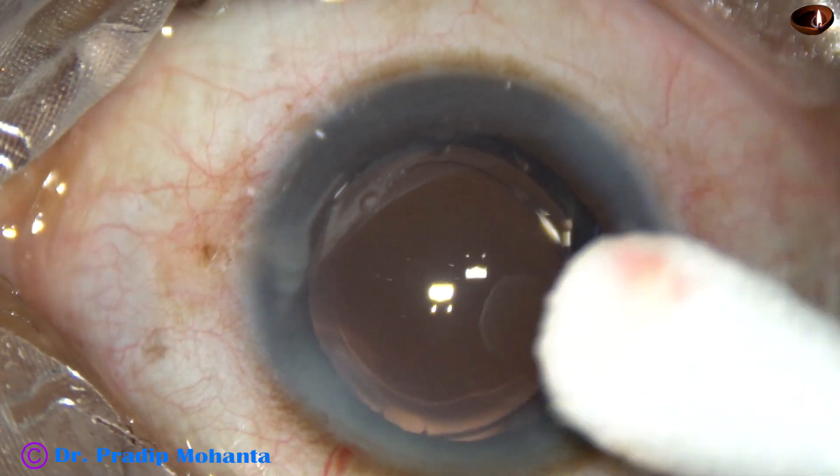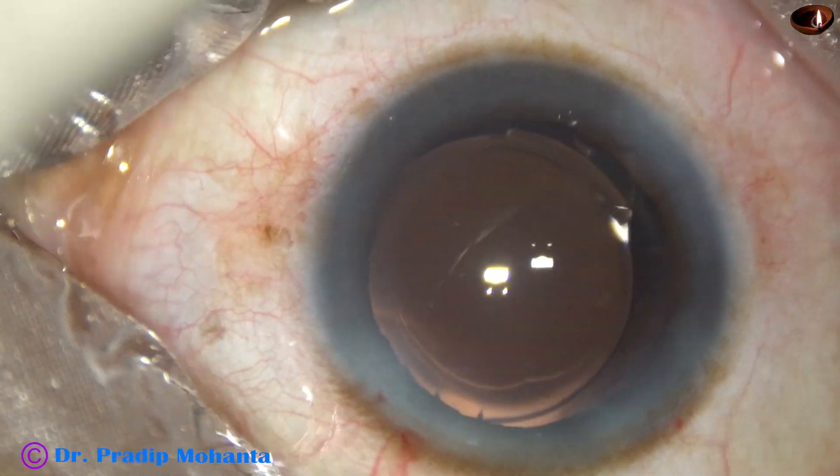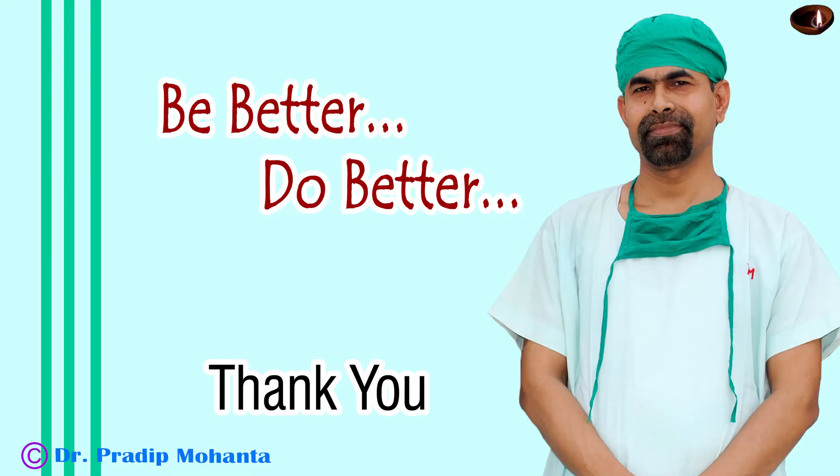Some few drops of moxifloxacin is applied. And then, the case is concluded. Thank you very much for your attention. Hope this video will help you in developing your surgical skills. Be a great surgeon and serve your patients with love, respect, empathy, and great surgical competence.